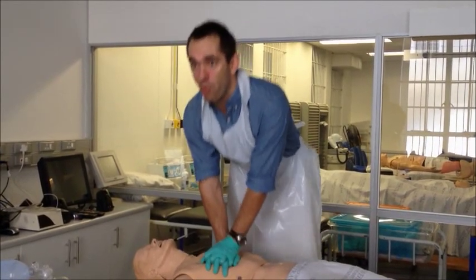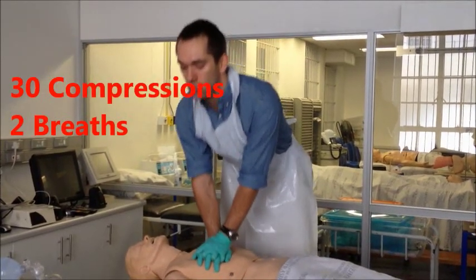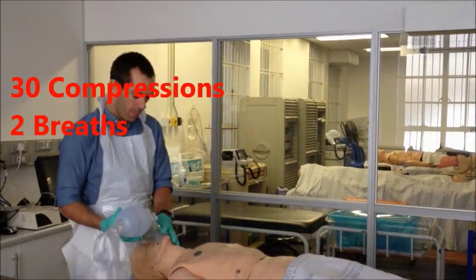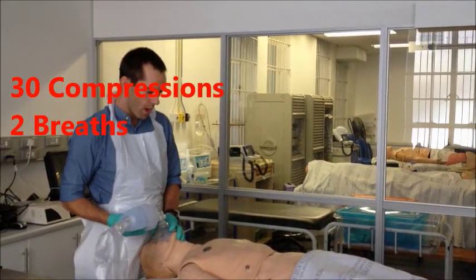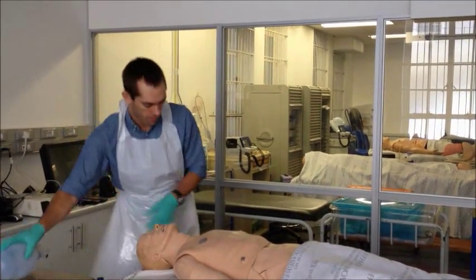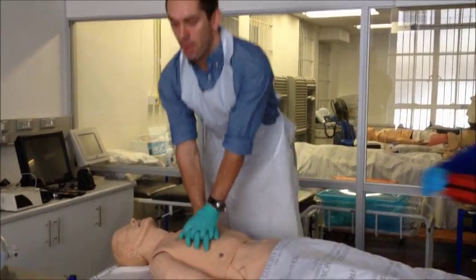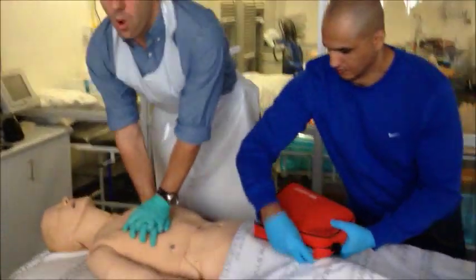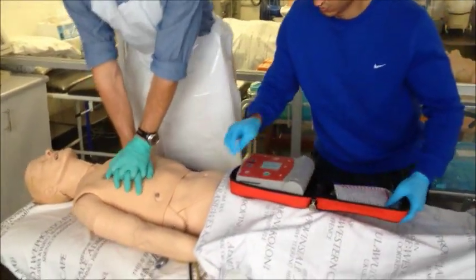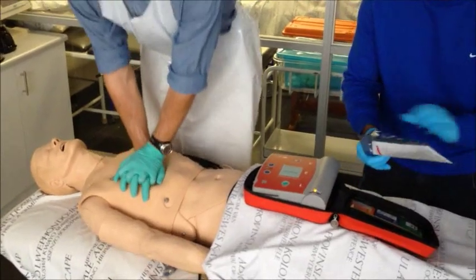I'm going to perform 30 compressions to two breaths. The AED arrives. While my assistant is preparing the AED for use, I continue CPR as I would even if the AED was not here.